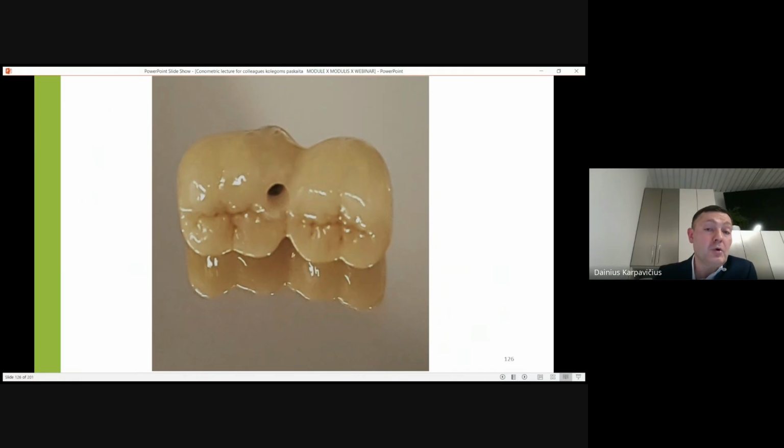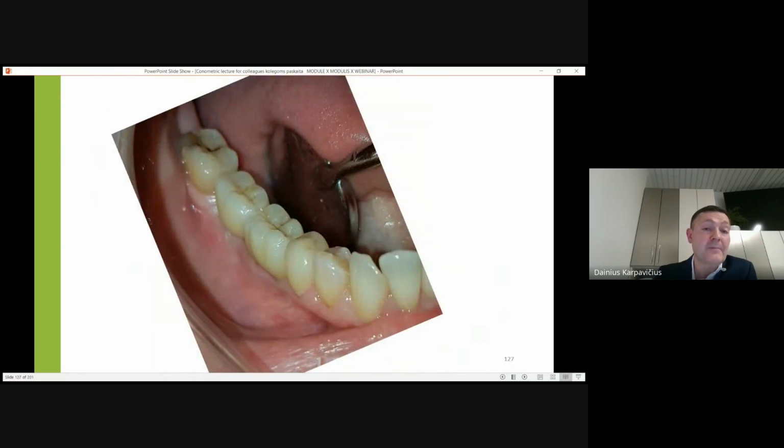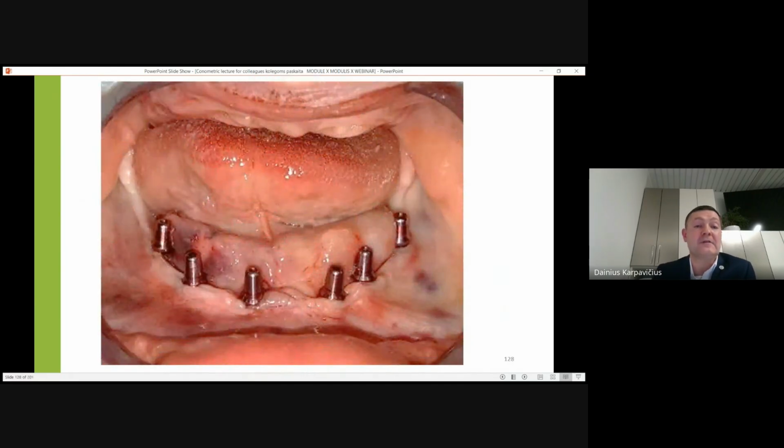So one open hole, and then the prosthetic comes back on the monolithic. So tell me, where is the difference between monolithic and two-piece classical? Because this is also the emergence profile. We have no cement, with retrievability, everything that is necessary.